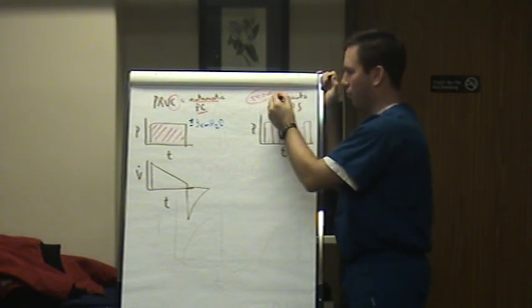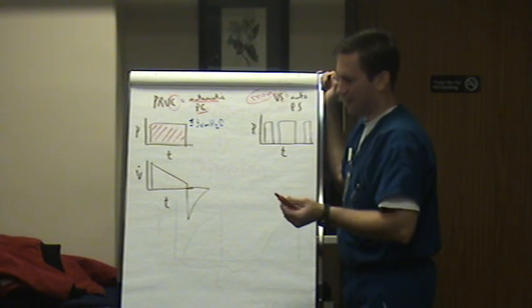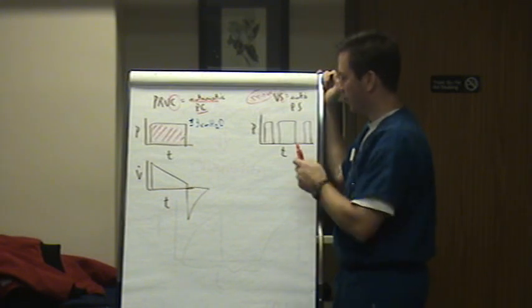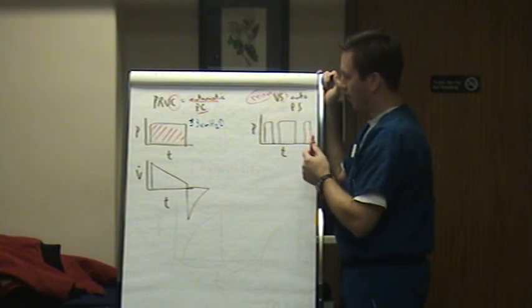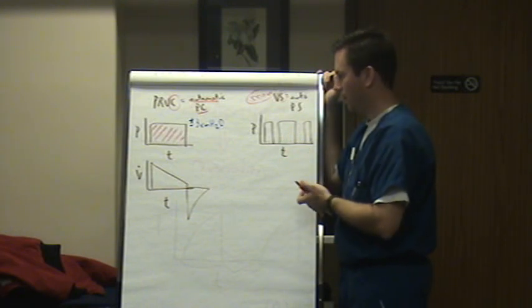That's the key though, it's a support mode. So your patient has to initiate every breath. There's no rate in this mode. So if they get a bolus of some sort of sedative or morphine or something, then you need to be watching that vent, watching that rate. So it is a support mode, so the patient has to initiate every breath. So volume support is to pressure support as PRVC was to pressure control. It kept us from going out of the room to adjust the pressure support mode.